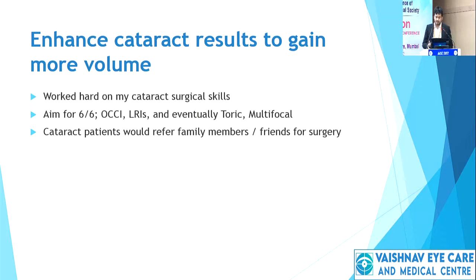I worked on my cataract surgical results. Right from the lower budget patients, I tried to aim for 6/6, hoping that toric and multifocal would follow eventually. I did OCCIs, LRIs, and obviously a good happy cataract patient would refer a few more cataract patients to you.